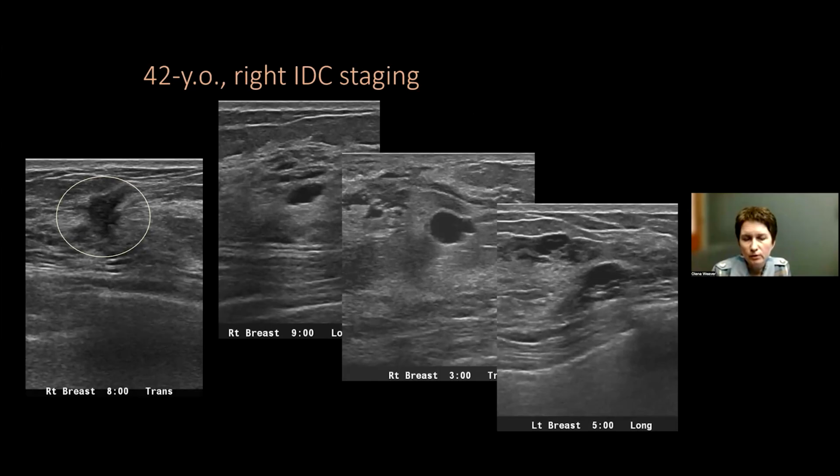And this was one of those cases that, after just struggling a little bit, one of my earlier cases, I dismissed it as background enhancement. So just keep in mind that in some cases, there will be so much patchy background enhancement, you just have to accept, just like with MRI, it's a limitation.